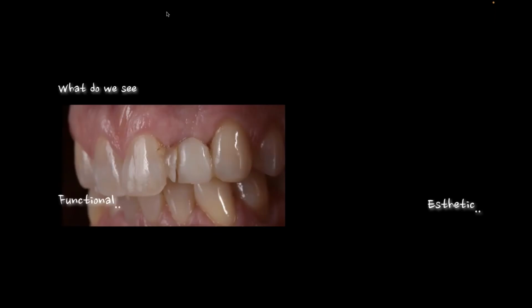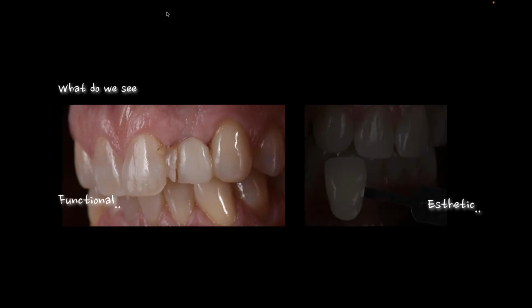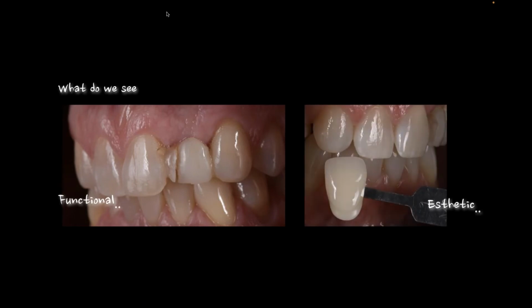So that's really what I'm looking at when I'm starting to look at my teeth. What is the enamel that I'm working with? I'm looking at this patient's teeth and saying, okay, I need to replace this. It's going to be an implant, which is complicated enough, putting one implant amongst all the natural teeth. But really what I have to figure out is, how am I going to finish the tooth? Because most of us are already starting to think about what abutment do I use, what material should I use, what shape is that lateral going to be?